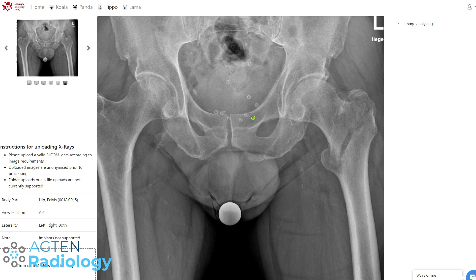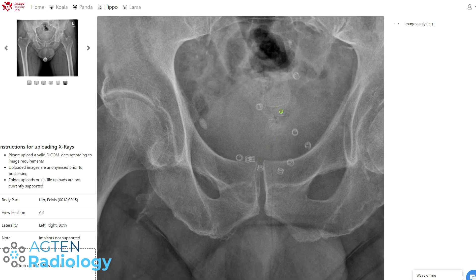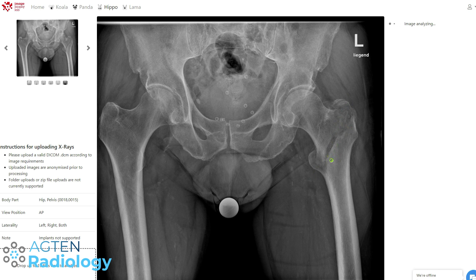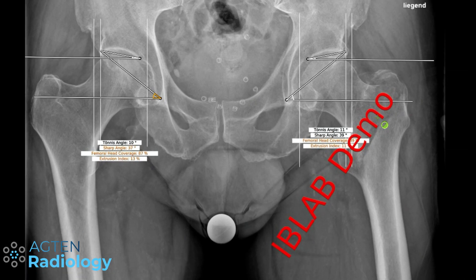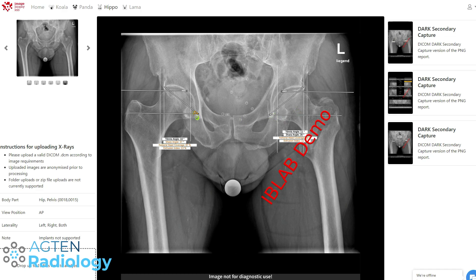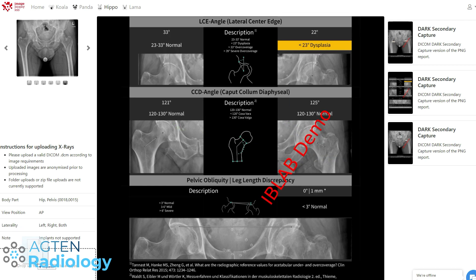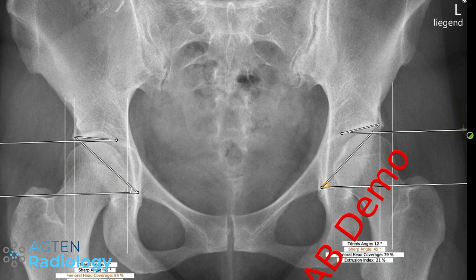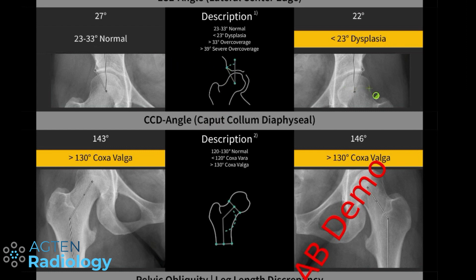This is now also an interesting situation: the image is not properly aligned — the coccyx is not in line with the pubic symphysis, so it's slightly rotated to the right side. The reason is a pertrochanteric fracture on this side. We'll now see how the algorithm behaves. There's no error — it does the angles, it does the extrusion index, and the points it's calculating look quite good. Let's do another one. You can see the points it's picking out — the extrusion index looks good. On the CE angle, it also highlights values below the threshold: here it's 22 degrees, and they have a dysplasia threshold of below 23 degrees, so it's borderline dysplastic.